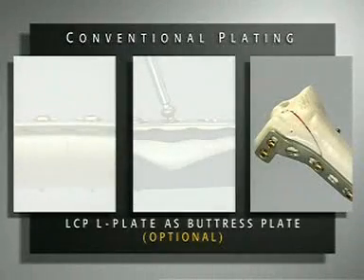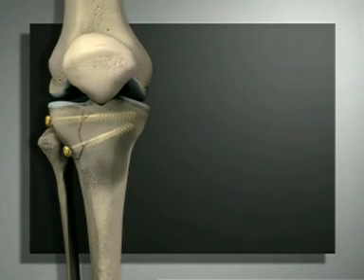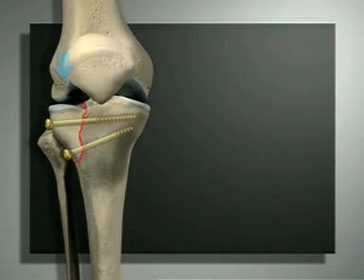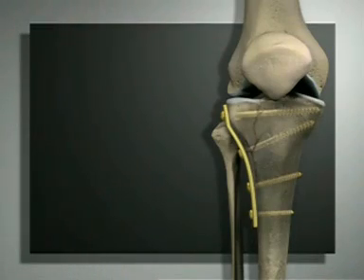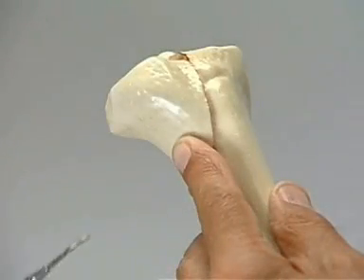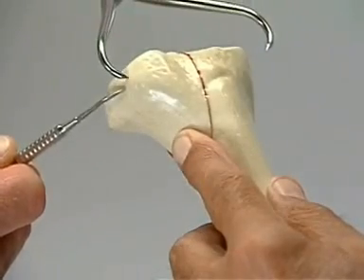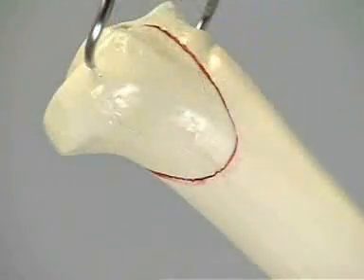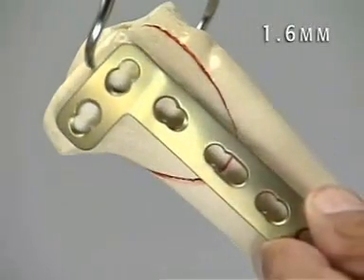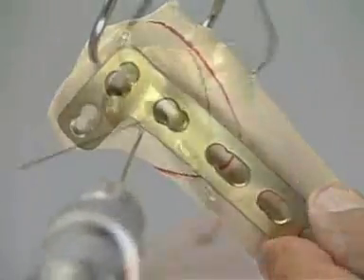In this exercise, an LCP L-plate as a buttress plate with lag screws is demonstrated. Intraarticular fractures are usually produced by shearing and bending forces. Fixation by lag screws only often cannot prevent secondary displacement in poor quality bone, and such displacement can be overcome by applying a plate to serve as a buttress. A split wedge fracture of the lateral tibial plateau is reduced anatomically and held in place with the large pointed reduction forceps. The plate may be used as a guide when securing the provisional fixation with two 1.6 mm K-wires, inserted at 90 degrees to the fracture plane so as not to counteract subsequent compression.